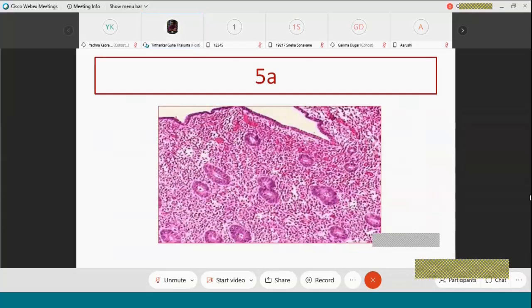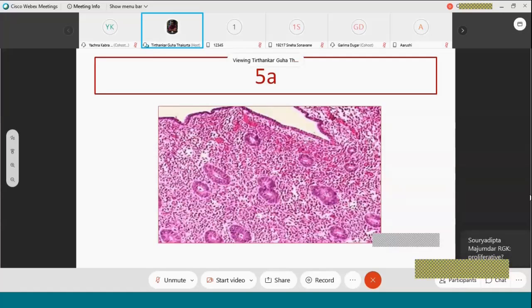This is a physiological slide as well. It's very good. It is the uterus. In the pathology syllabus, it is given as endometrium, but that is basically the uterus. So what stage of the endometrium do you see here? Is it proliferative phase or secretory phase? Round glands with dense stroma or convoluted glands?